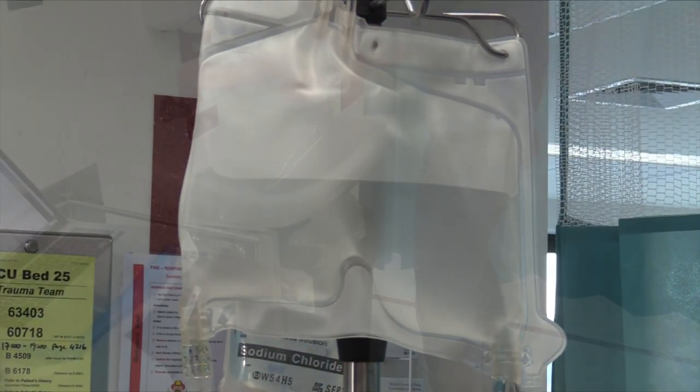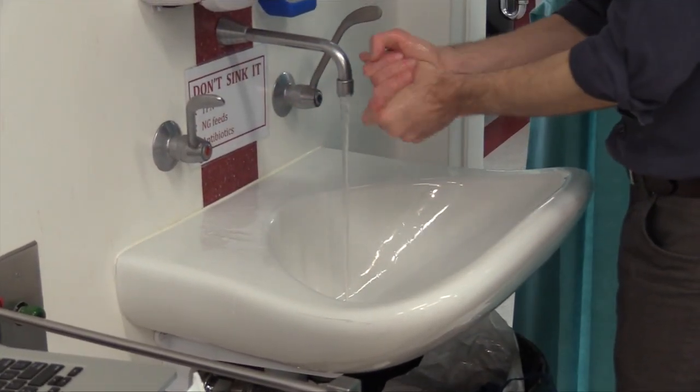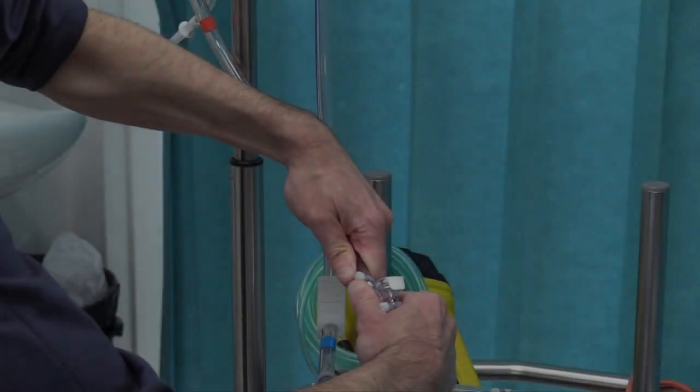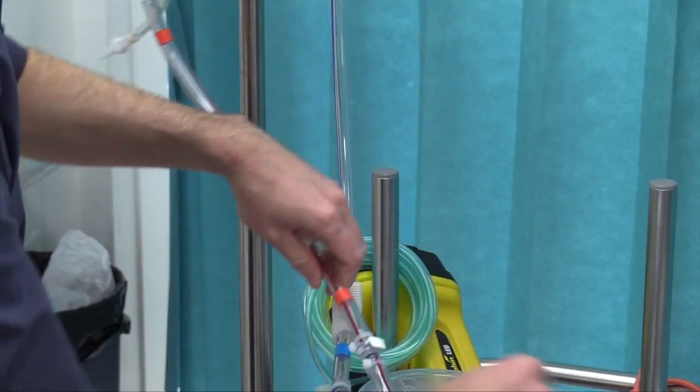The HLS cardio help system does not require pre-priming; it is designed to be primed at the time of ECMO commencement. Therefore sterile attire and CO2 priming are not required. All circuit connections however should be performed with a no-touch technique.